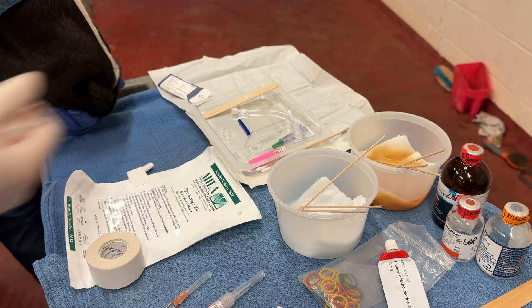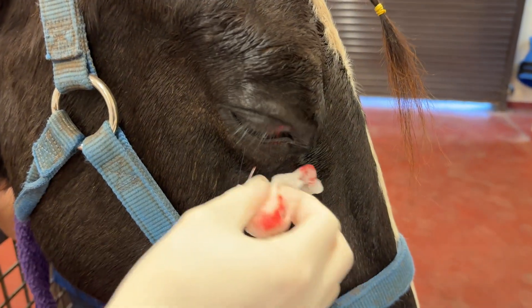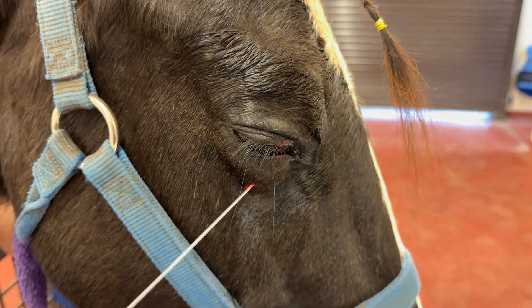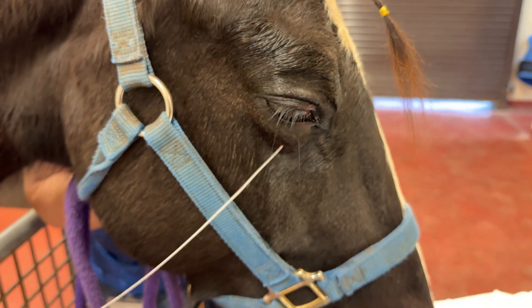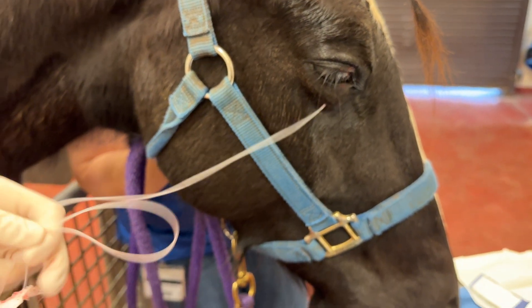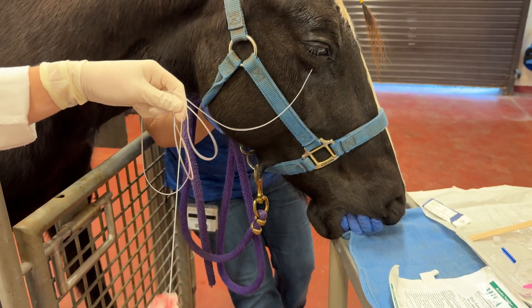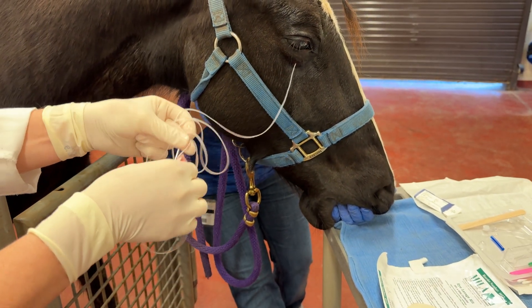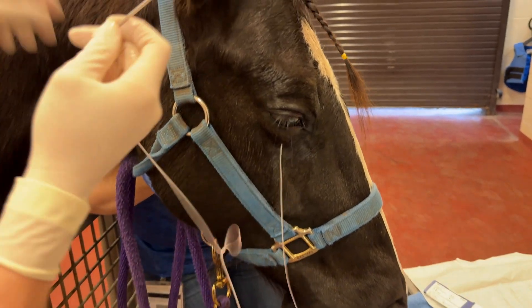Here I am demonstrating that the lavage line can be placed in the lower eyelid, but it can also be placed in the upper eyelid with very similar technique. You're just going to be driving the trocar through the upper eyelid centrally, and when you do that you still want to be right up against the bony orbit so that you are at very low risk of that foot plate causing any corneal ulcers.